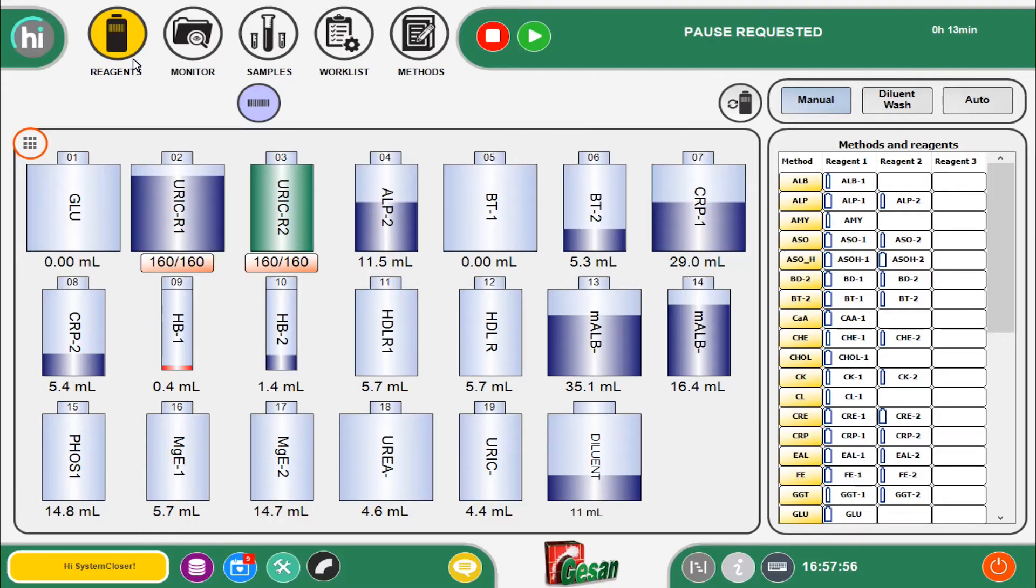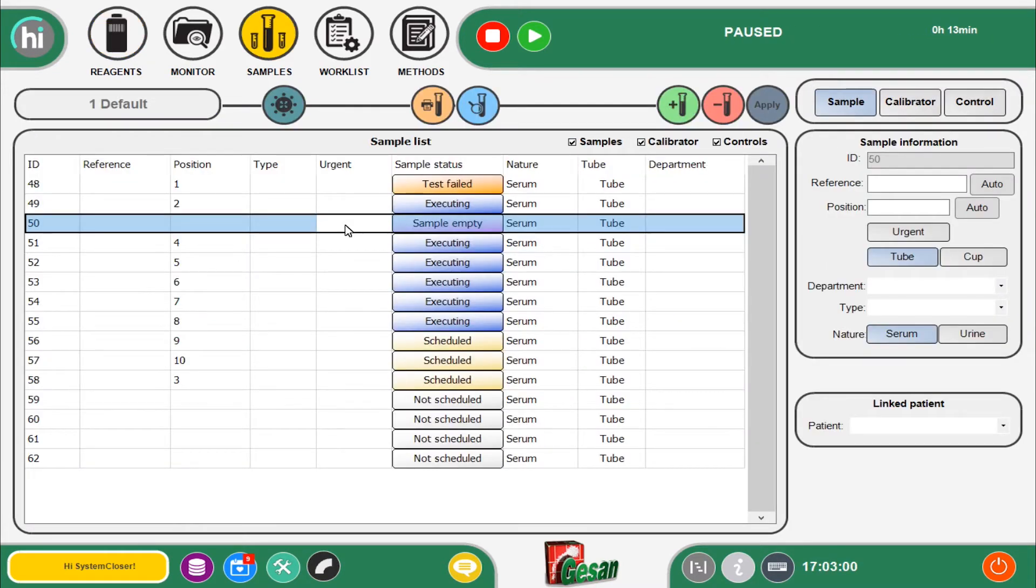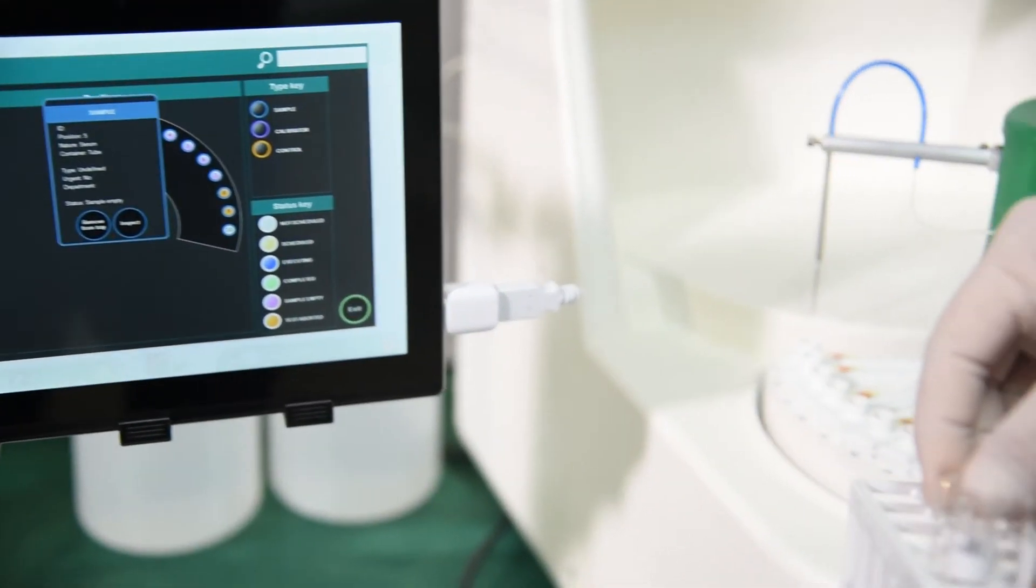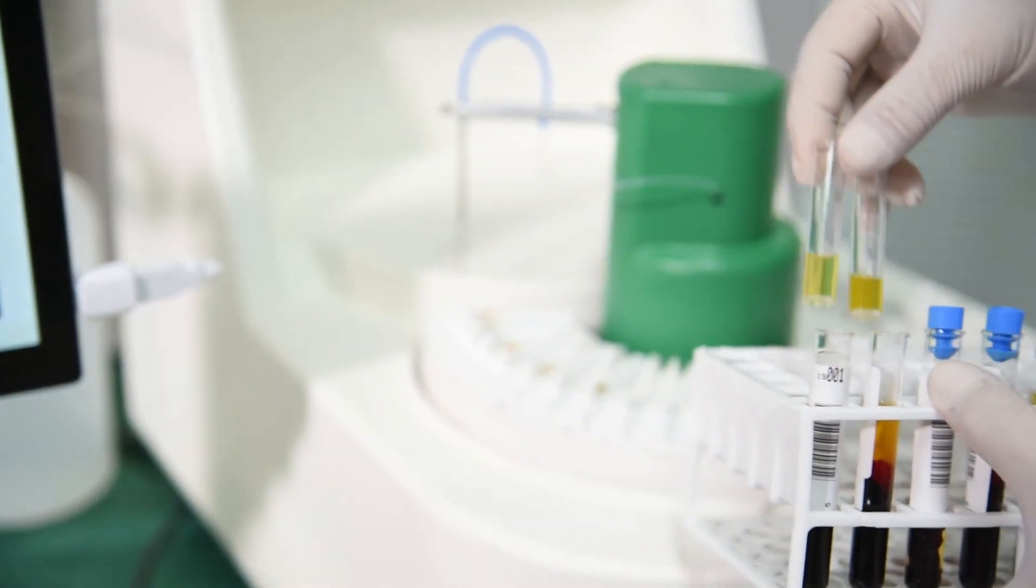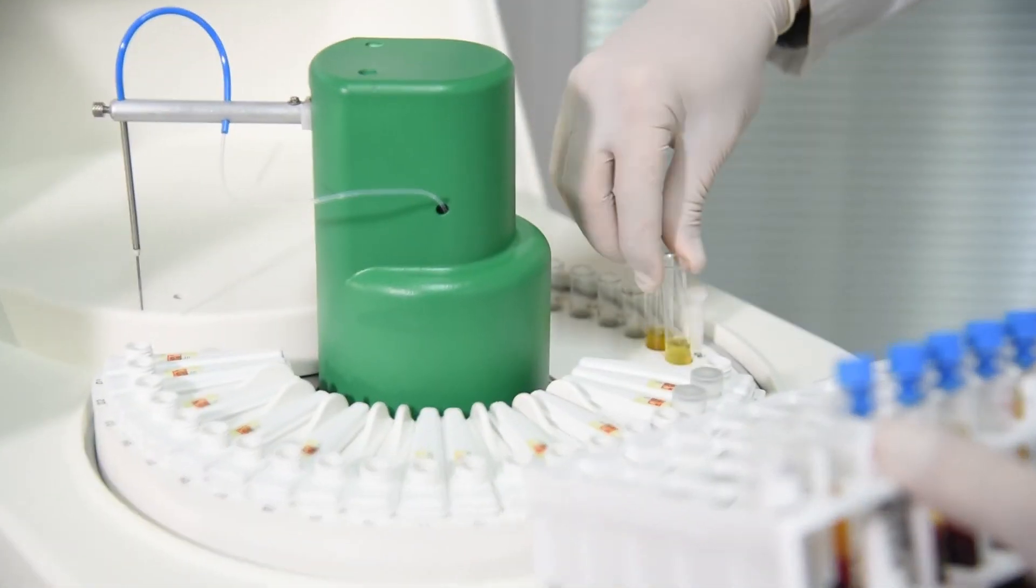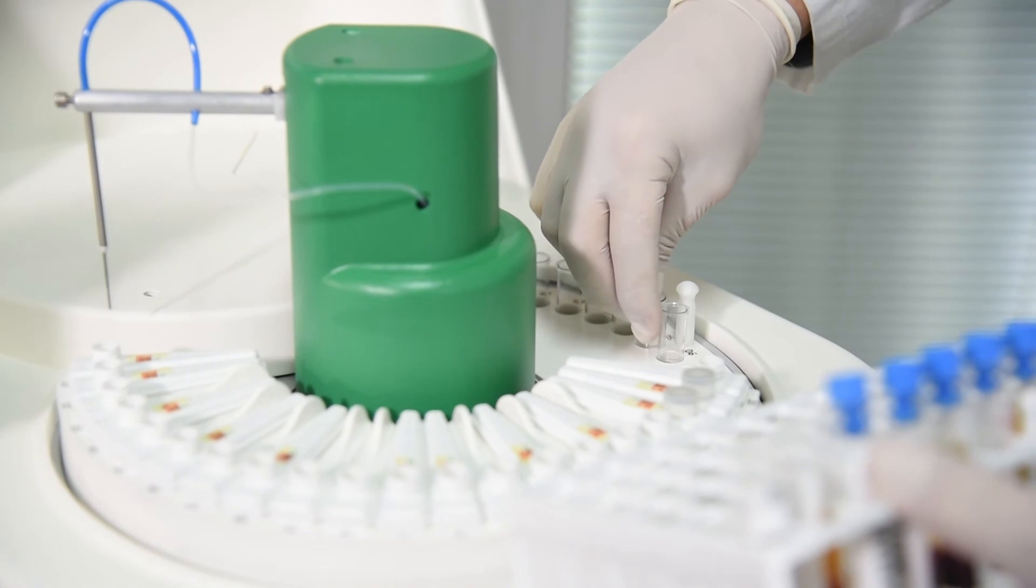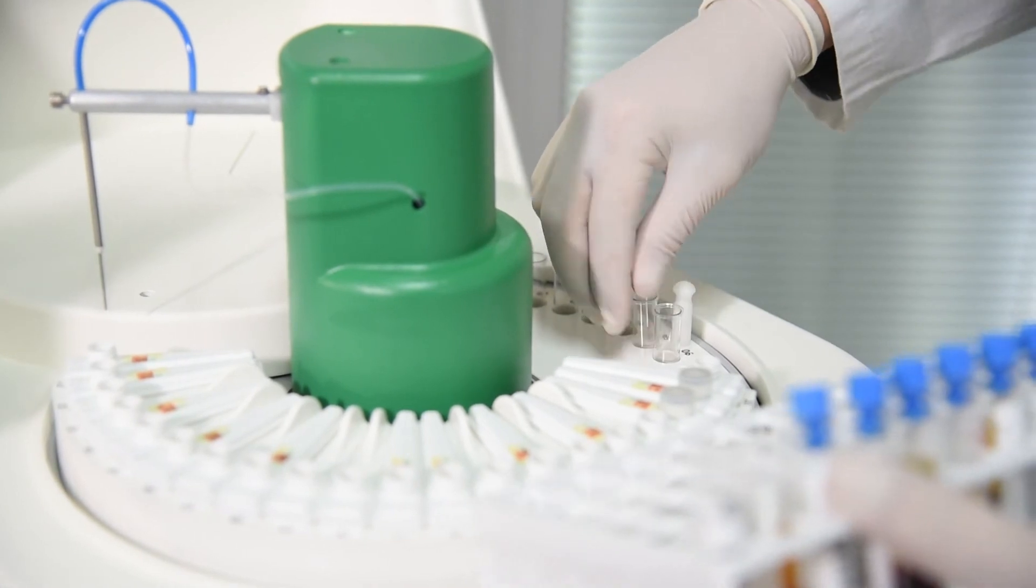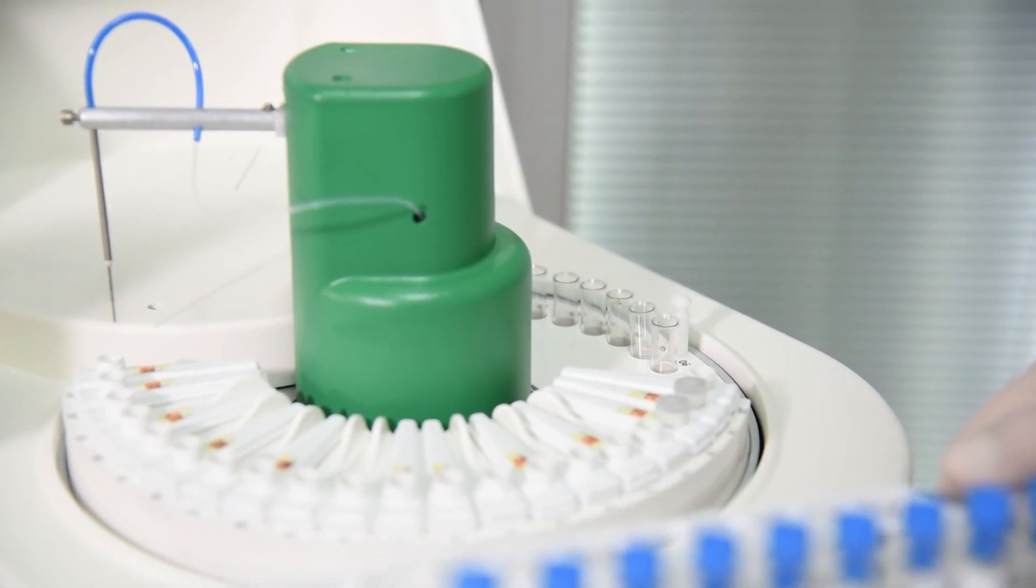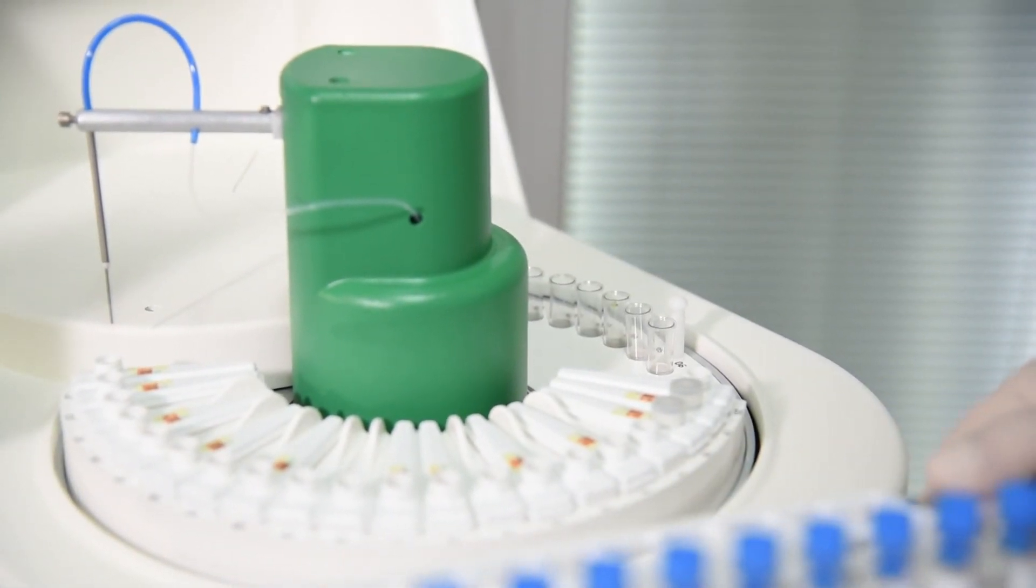The running state can be interrupted without losing the current test using the pause function, allowing the operator to continue loading samples, calibrators, controls, or reagents and then restart execution in progress.